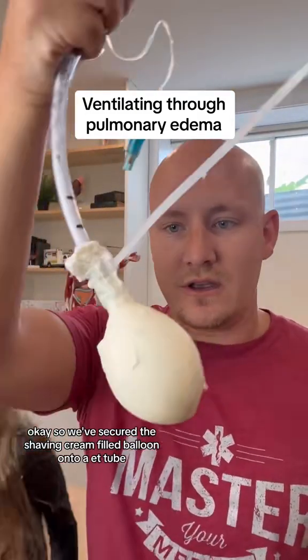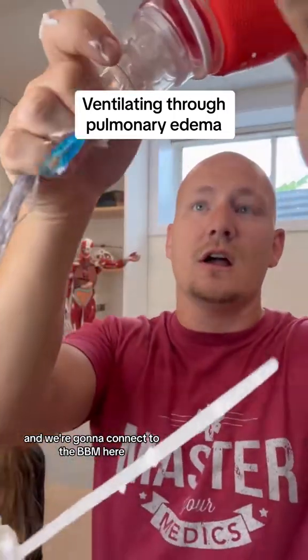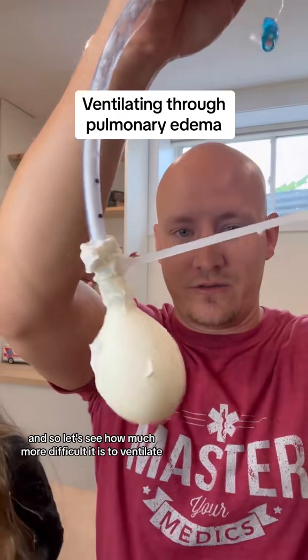We've secured the shaving cream-filled balloon onto an ET tube and we're going to connect to the BVM here. Let's see how much more difficult it is to ventilate.